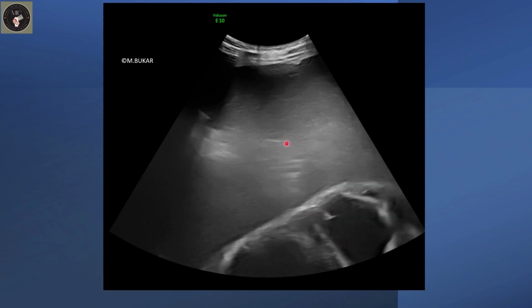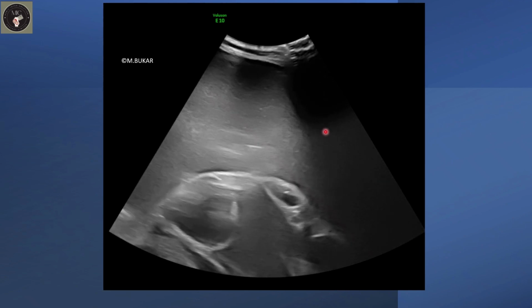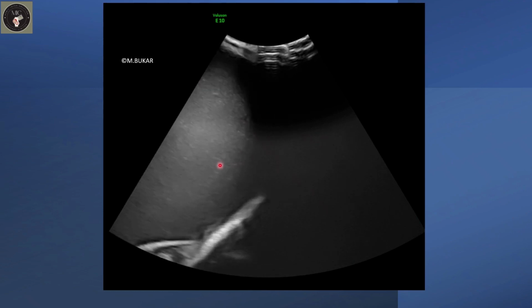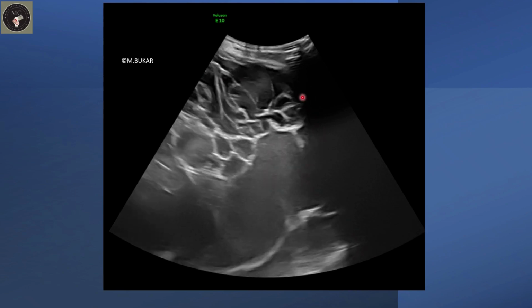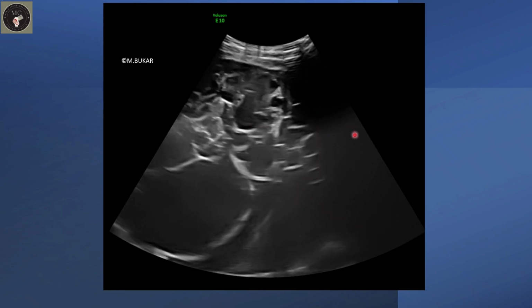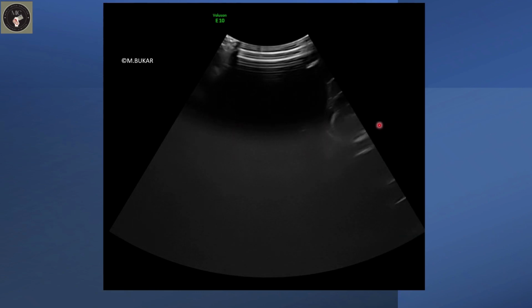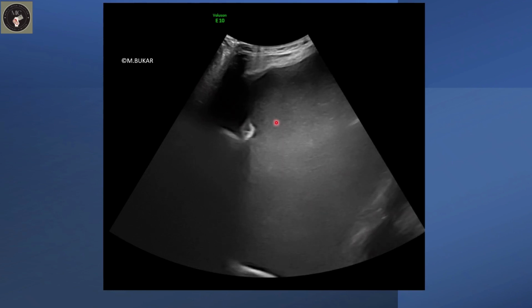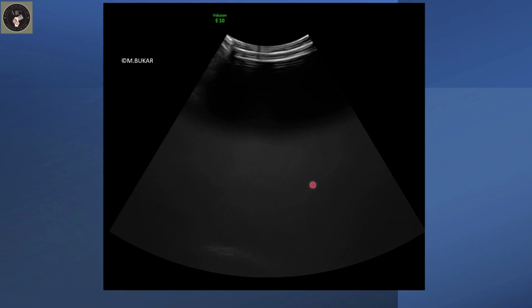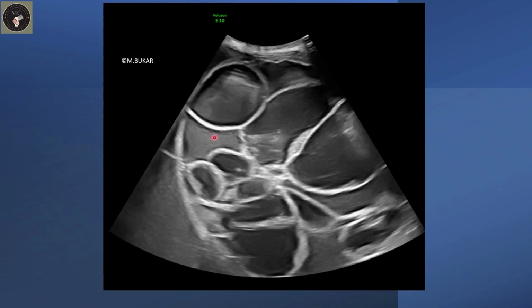Here is what looks like ground glass appearance. These are features of mucinous tumor. Note the stretched out uterus there, and what looks like the honeycomb nodule here, which is a feature of mucinous borderline ovarian tumor of the gastrointestinal type. Note the regular septae.